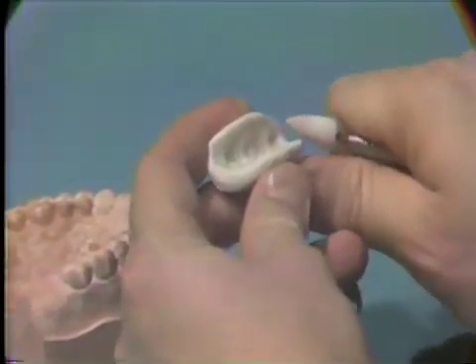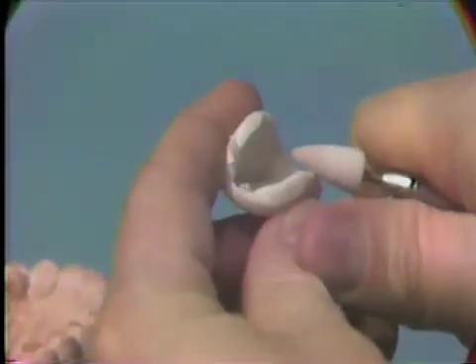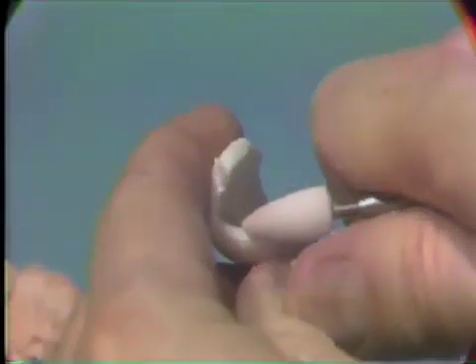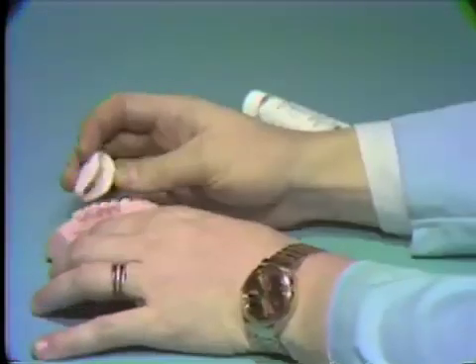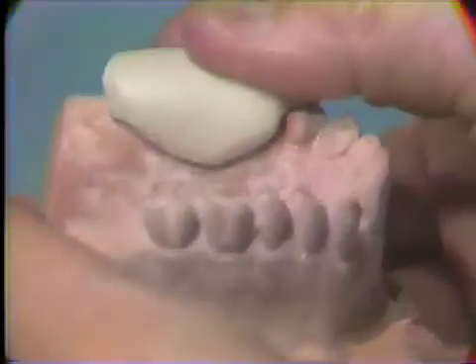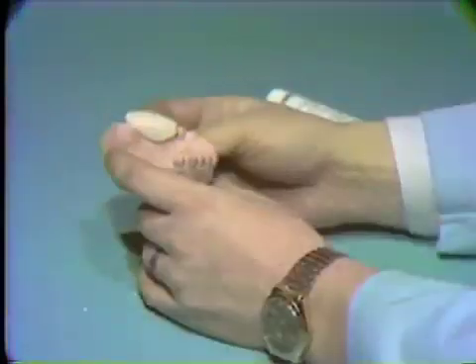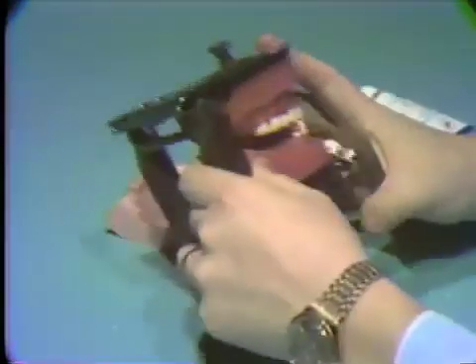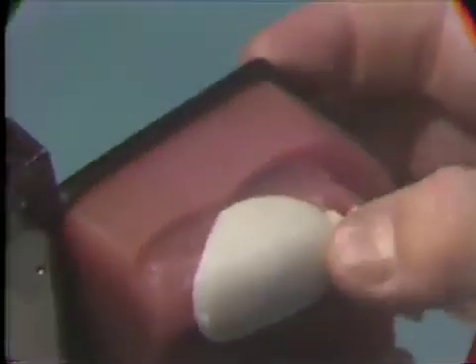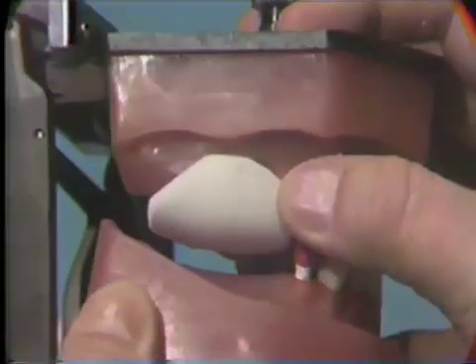Remove the bite block as soon as it has cured, and trim the sharp edges and excess away with the fast cut stone. During the trimming procedure, place the bite block back on the maxillary stone cast so you can check it for fit, extent, and stability. Now place the bite block on the articulated visodont maxillary model to be sure it fits. Close the visodont and check to be sure the block does not contact the opposing edentulous ridge, and that it is wide enough to oppose the width of the opposing edentulous ridge.